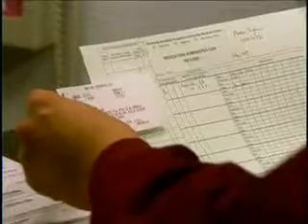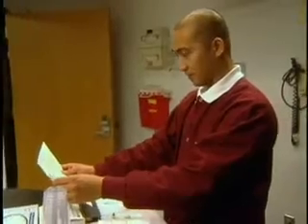Good. You know, the label should include the patient's name, ID number, medication name, the name and volume of the solution for dilution, and dose, date, and time. And you're going to double-check all of this against the MAR. All right. I think it's set. Let's do it. There's the confidence.